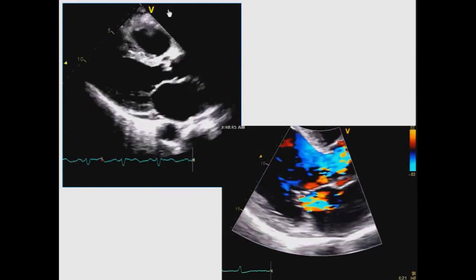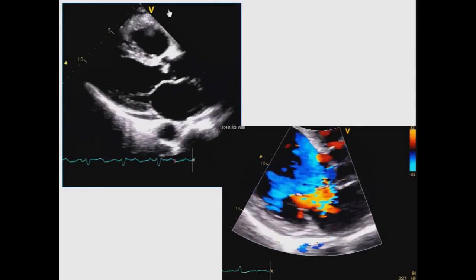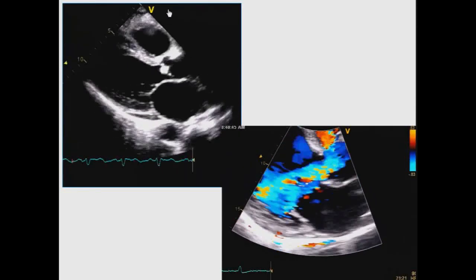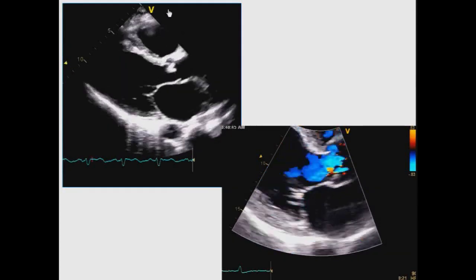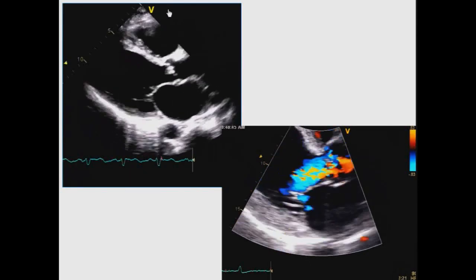They're asking about the number of beats to determine intracardiac versus extracardiac shunt. That's a tough question, but a better response for a tough question is to say, I happen to have a slide. All right? Can you just send me the slide?